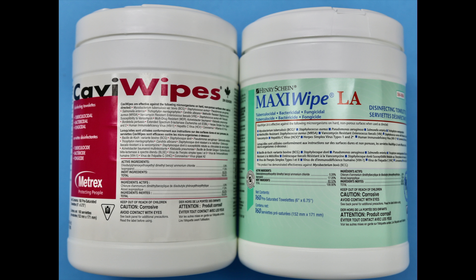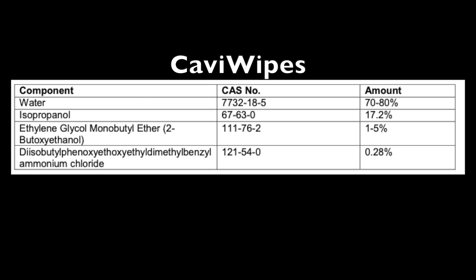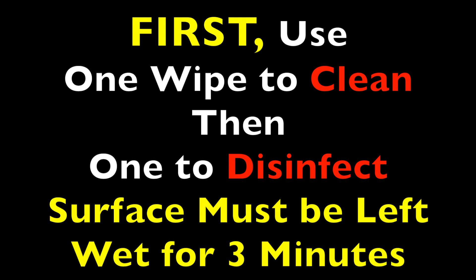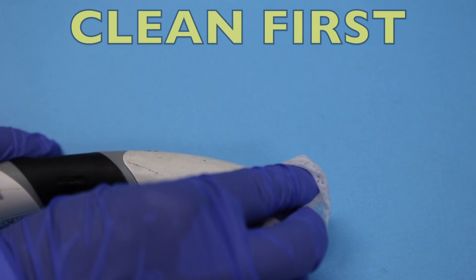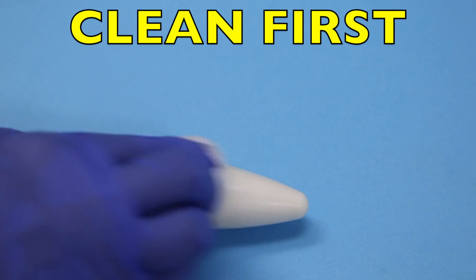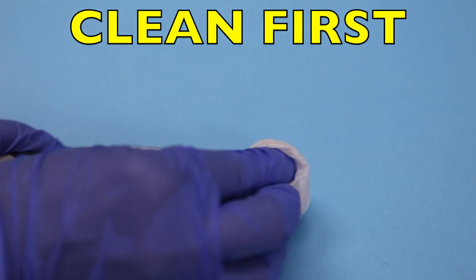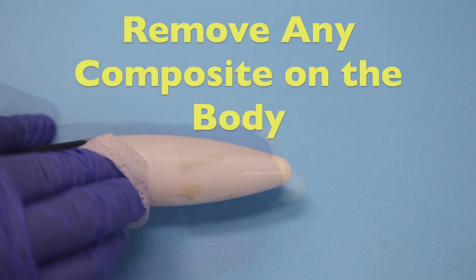Here we're using CaviWipes, but a similar product such as MaxiWipes could be used and neither product should damage the light or the light guide. First, we'll use one CaviWipe to clean and then we'll disinfect afterwards with the second wipe. When we're cleaning, you'll notice that we're going from one end to the other.